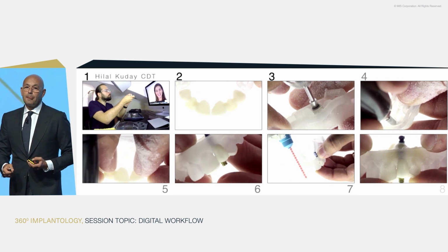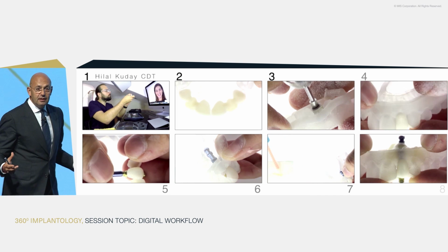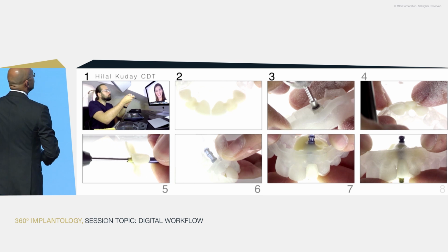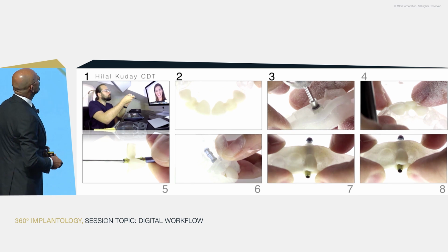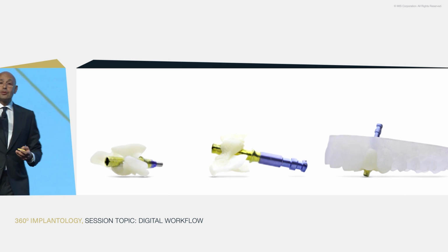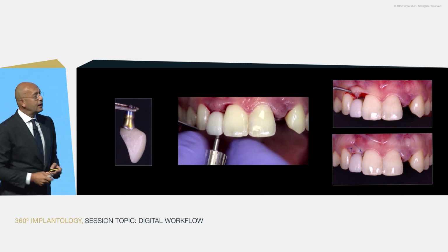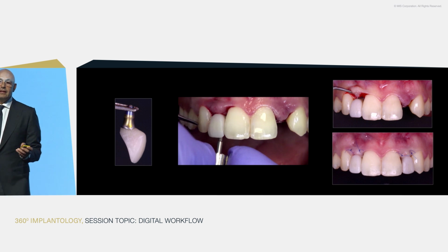this is what we will be getting. It's as if we took the analog and placed it into a stone model, but we didn't waste a minute. This is what we're doing while the patient is having surgery next door. So this is, again, a same-day happening, what I'm trying to explain to you. So once we completed all these, simply we go to the next stage, and this is the captured one, and this is how we fixed it on the model, but with the right contours now. And then this is the contour we wanted to create. And simple enough, we're just screwing it in on the day of surgery. This is in, the second one is in, so everything is nice and quiet.